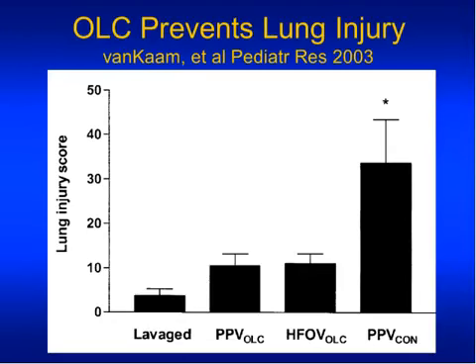And this has to do with the dead space of the flow sensor. So when the flow sensor dead space is whatever it is, 0.8 ml, and the baby's a kilo, it has a significant impact. When the baby is half the size, the flow sensor dead space is still the same, so it has a bigger impact, and that's why you need a little bit of compensation in those really tiny babies. So it seems a bit counterintuitive. People try to leave these little babies at smaller tidal volumes per kilo, but that would be the wrong thing to do. And now you see why.